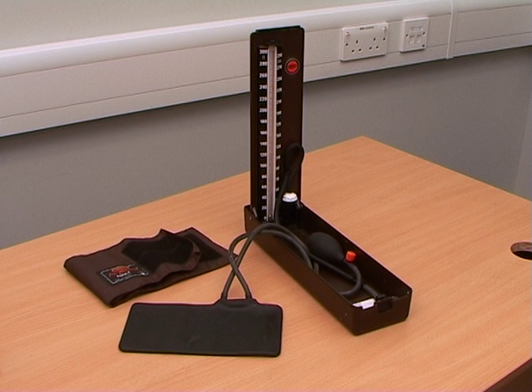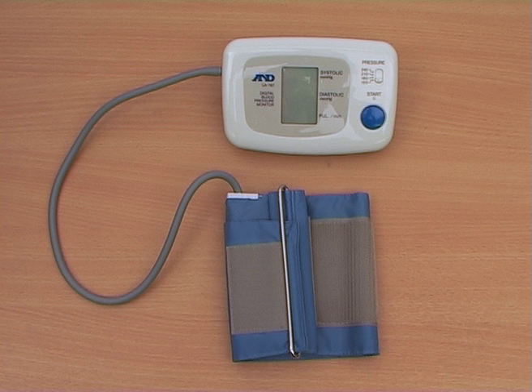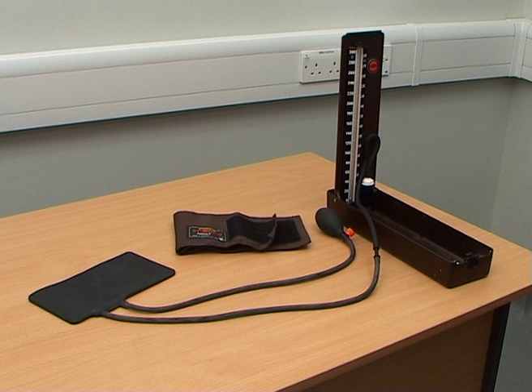Let us now describe the sphygmomanometer. There are three basic types: the old-style mercury, the aneroid, and electronic ones. The mercury sphygmomanometer is made up of a vertical column of mercury, which is the manometer, connected with a tube to a cuff. The cuff contains an inflatable bladder which is connected to two tubes — one which sends the pressure to the manometer, and the other which is connected to a pump. To pump up the cuff, you need to close the valve.